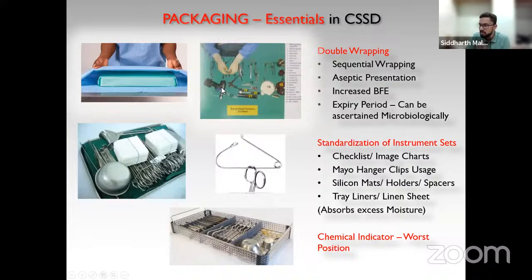There are some packaging essentials. If you are using it inside the OT, you should always go for double wrapping, even if it is with linen, even if it is with your SMS wrap. A double packing ensures aseptic presentation. That means the sister who is going to take it out, put it on your Mayo trolley tray and open it up is separated from the person who is finally using it. That's called an aseptic presentation.